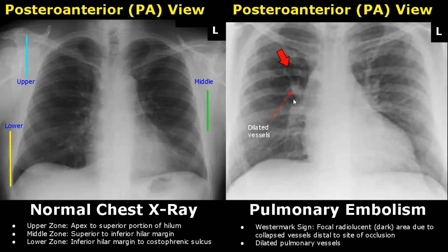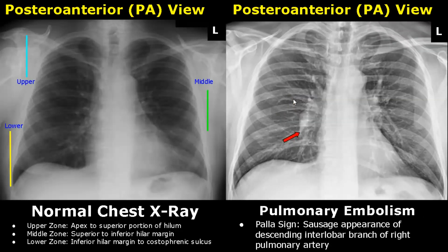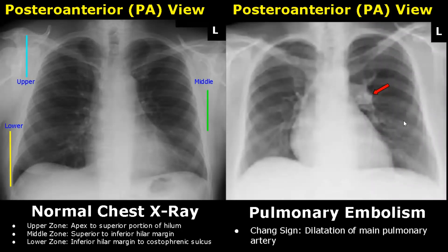The Palla sign is another feature of pulmonary embolism — the descending interlobar branch of the right pulmonary artery appears sausage-shaped, which is a distinctive feature. In the Chang sign, dilatation of the main pulmonary artery is seen. It is very bright, whereas in the normal image it is not prominent and bright.